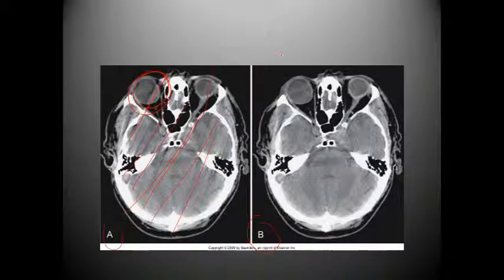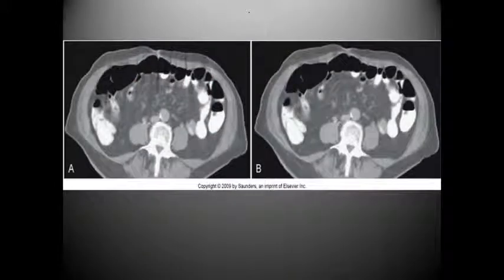Even very slight motion can cause this. I've actually had patients breathe kind of heavily through the mouth, and as they are breathing in and out, their head is slightly rocking back and forth, and that results in this pattern.